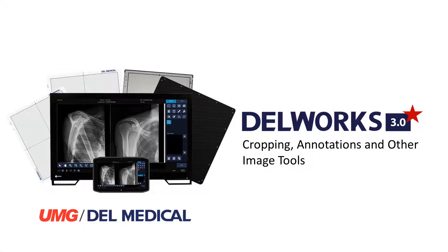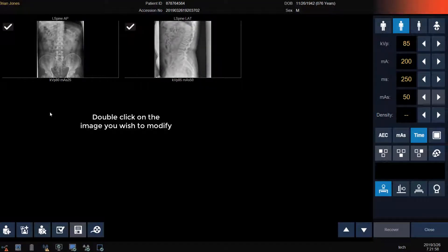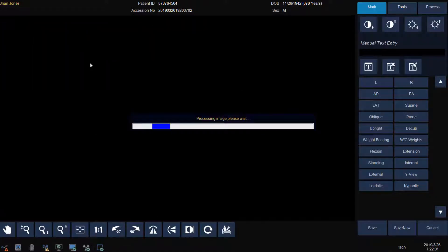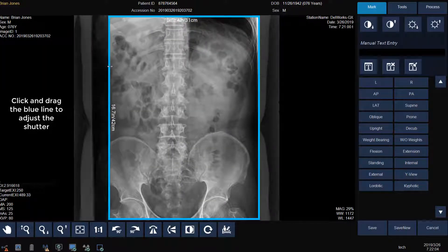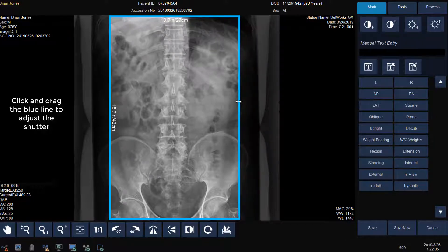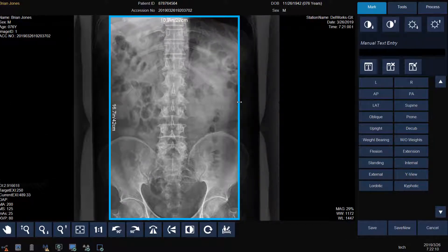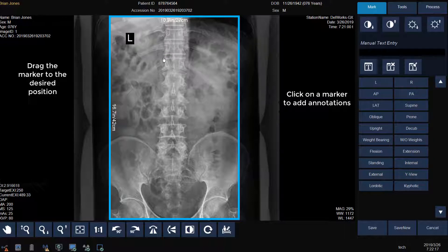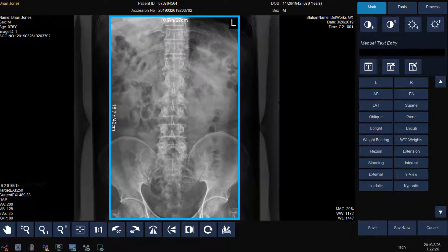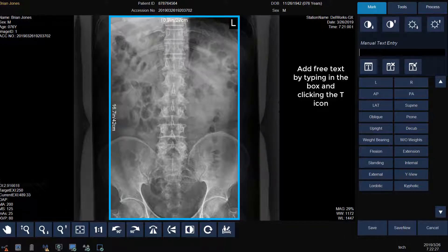Next, we will review the tools needed to modify your image, such as cropping, annotations, and other imaging tools. Double click on the image that you'd like to modify. To adjust the shutter, drag the blue lines in or out. To add a text annotation, click on one of the predefined markers and then drag it into the desired position. To add free text, type in your annotation in the manual text entry box, then click on the T icon to set the annotation on the image and drag it into position.